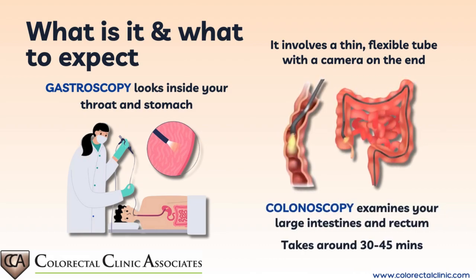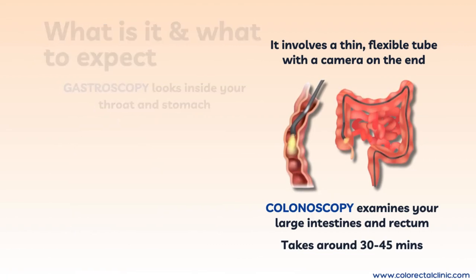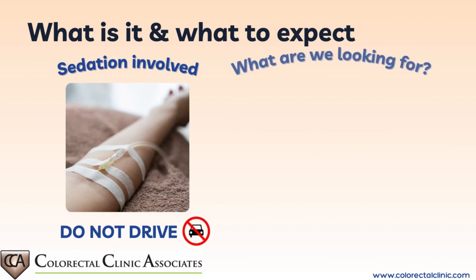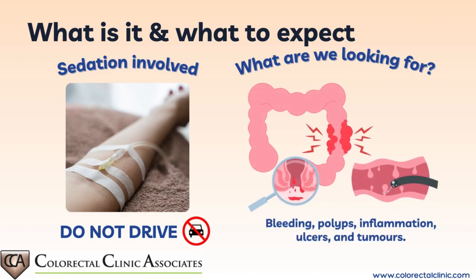Both procedures will take around 30 to 45 minutes in total. You will be given intravenous sedation for the procedure. It is not safe for you to drive after the scope, as there may be remnant effects of the sedation. During the scopes, we are looking for any bleeding, polyps, inflammation, ulcers, and tumors.